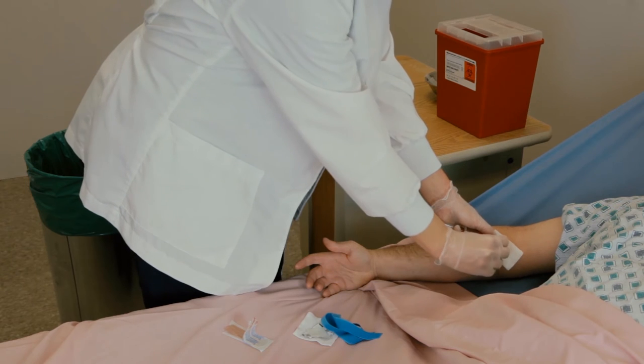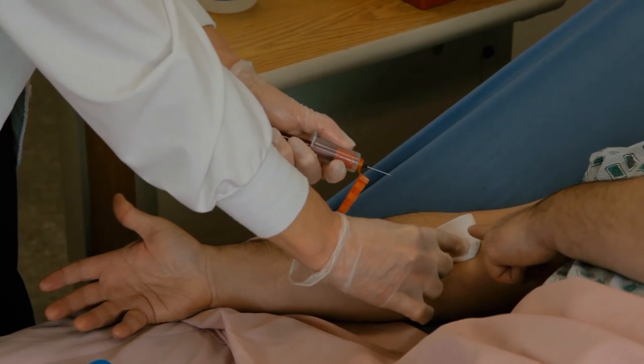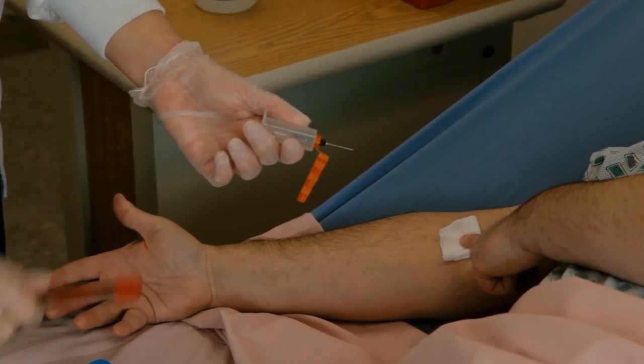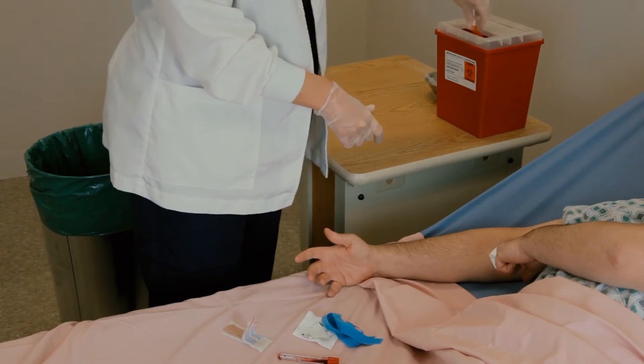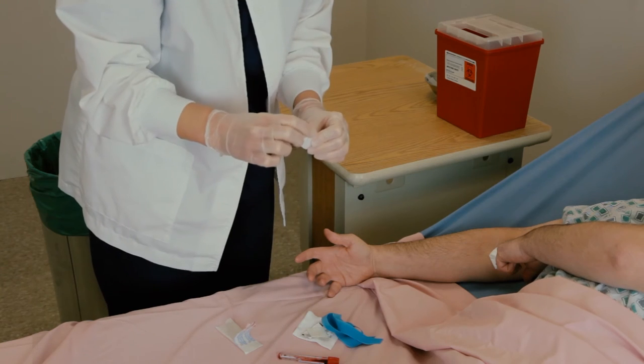Notice that the tourniquet has been placed in the discard pile. This provides a visual cue to the caregiver and the patient. When possible, the patient or family should be encouraged to participate in this process because they too can help assure the tourniquet is removed.